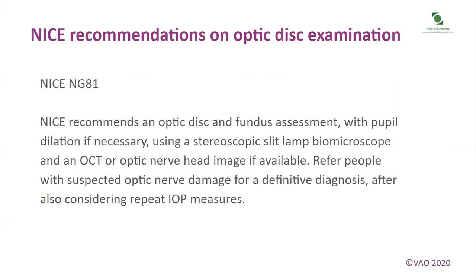NICE NG81, for use by optometrists in the UK, recommends an optic disc and fundus assessment with pupil dilation if necessary, using a stereoscopic slit lamp biomicroscope and an OCT or optic nerve head image if available, and to refer people with suspected optic nerve damage for a definitive diagnosis after also considering repeat intraocular pressure measurements.